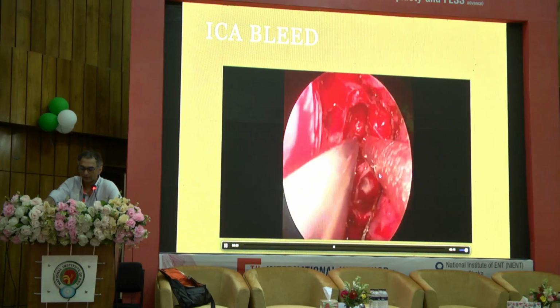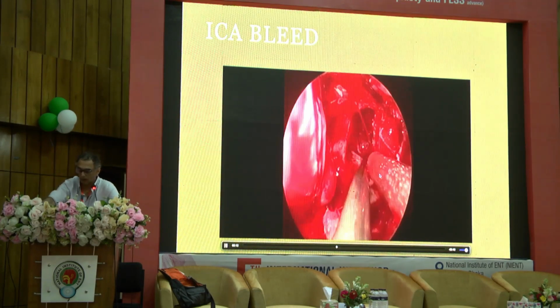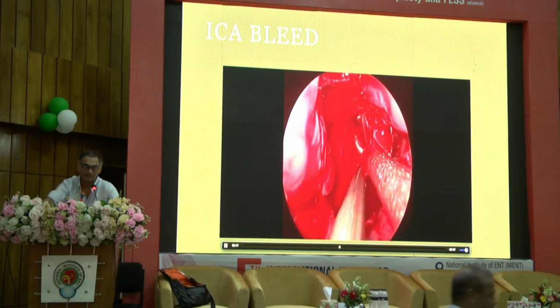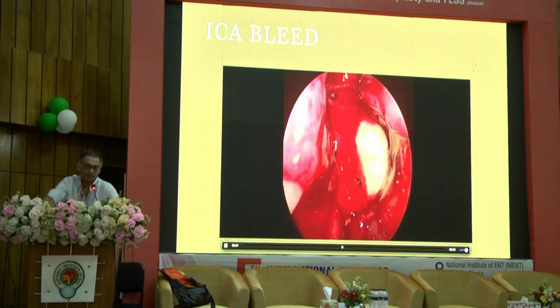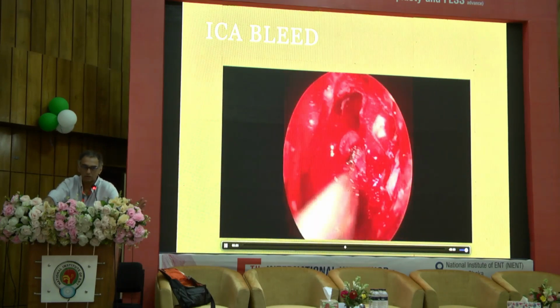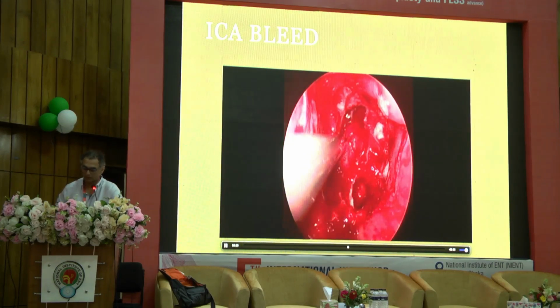So that's the Floseal that went in. You have to take out the patty for that. And when you put Floseal for an arterial bleeding as against a cavernous sinus bleeding, it's completely different. It takes like 1 second for the Floseal to get washed off. Nothing, there's no chance. So you have to get back to that muscle, keep the pressure on.